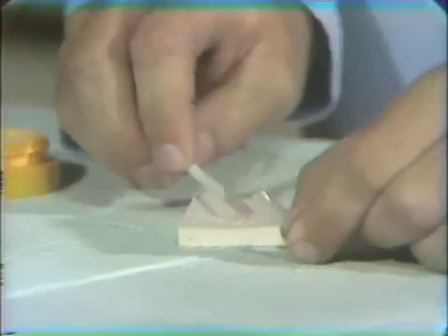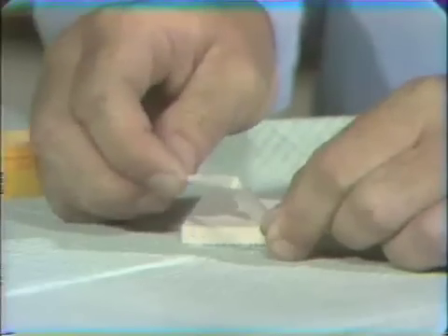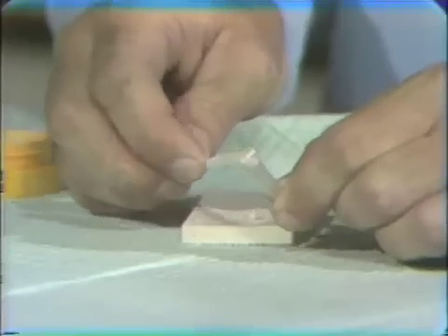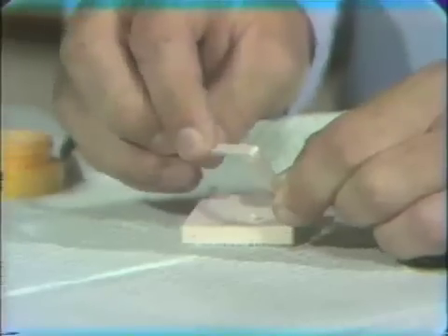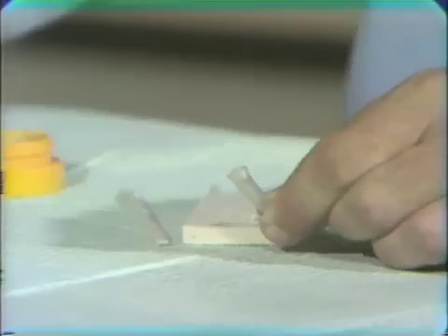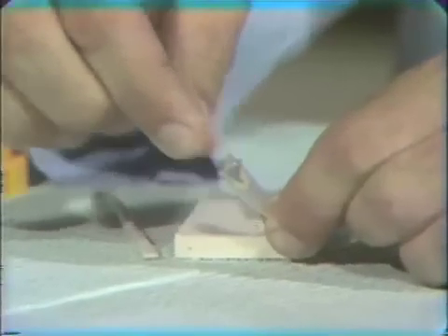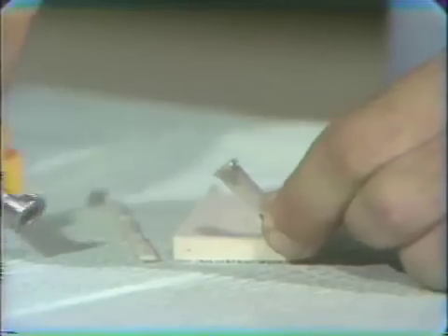Now this is transferred to the small disposable plastic tube, right from the spatula. The plastic insert is now placed in here and pressed just even with the orifice. Now it is placed into the syringe.